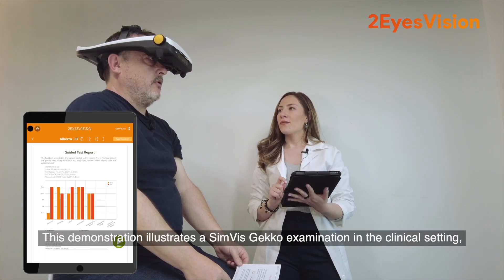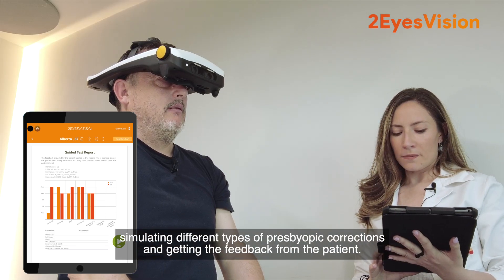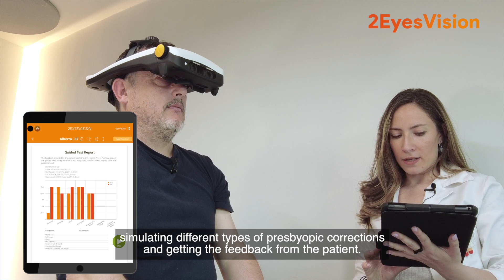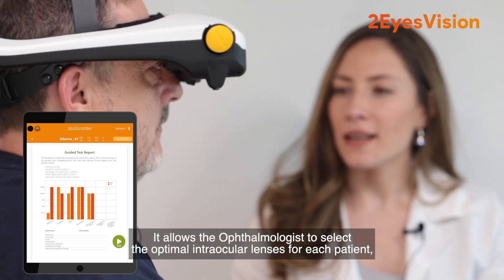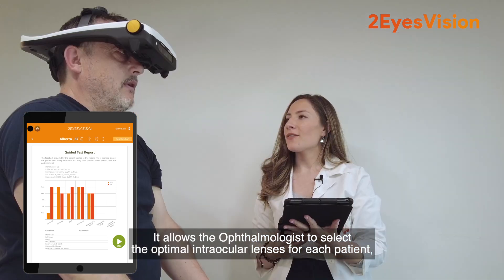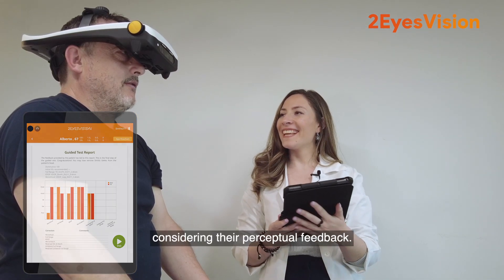This demonstration illustrates a Simvis Gecko examination in the clinical setting, simulating different types of presbyopic corrections and getting feedback from the patient. It allows the ophthalmologist to select the optimal intraocular lenses for each patient, considering their perceptual feedback.